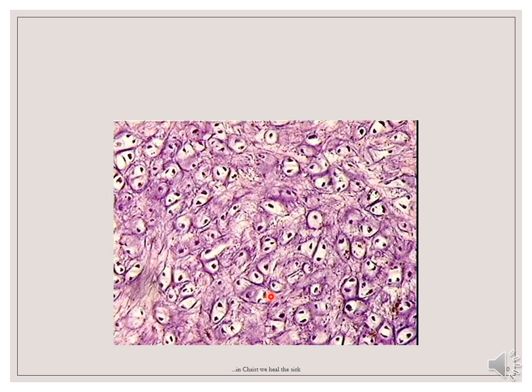In addition to the type 2 collagen found in the matrix of cartilages, the matrix of the elastic cartilage contains numerous bundles of branching elastin fibers. Elastin fibers stain black or dark purple with elastin stain. So here our elastin fibers are appearing dark, and this dark network of fibers can be seen throughout the extracellular matrix. We can see a network of fibers running through this extracellular matrix — unlike what we saw in our hyaline cartilage where we have a homogeneous matrix.